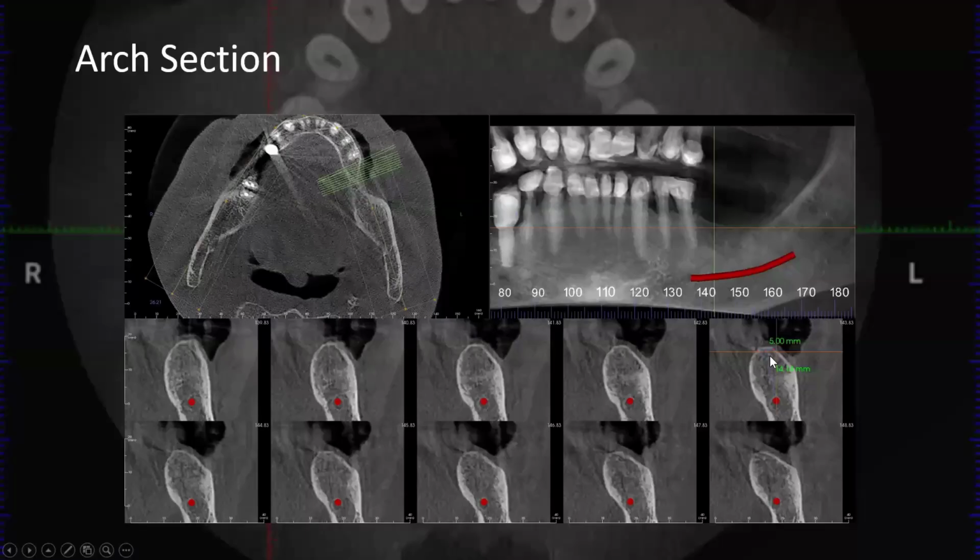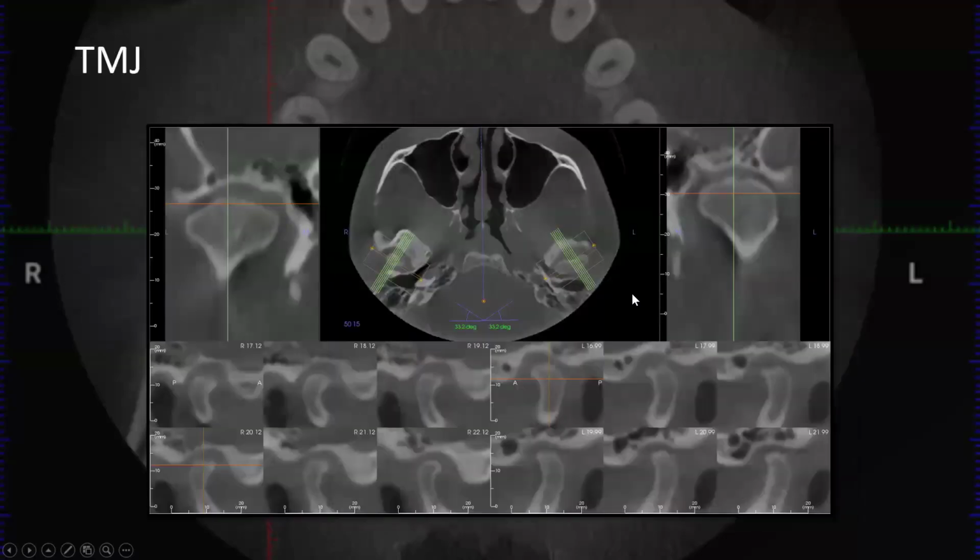Then we have measurements. Sometimes you'll see that, based on the direction you need that implant to go into occlusion with the opposing teeth, there may be a buccal defect. It may look like there's plenty of bone, but it slants toward the lingual. And so you got to measure to where you want that neck of the implant to be. So a lot of variation you can have.